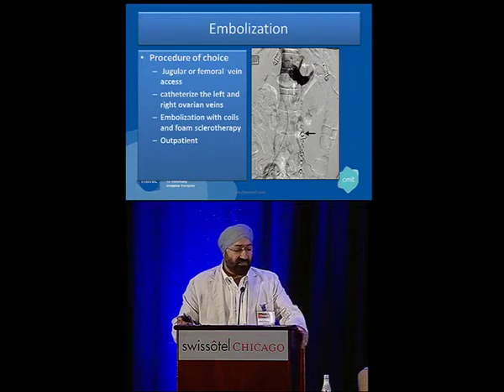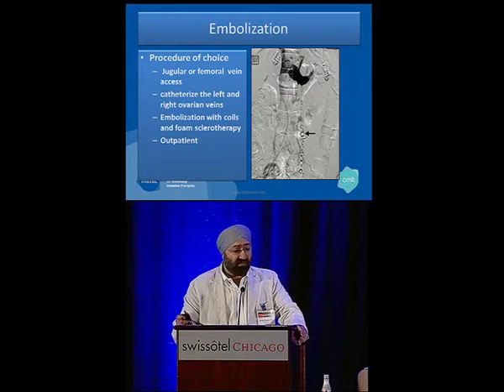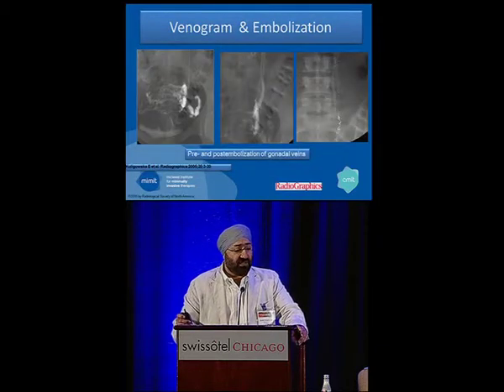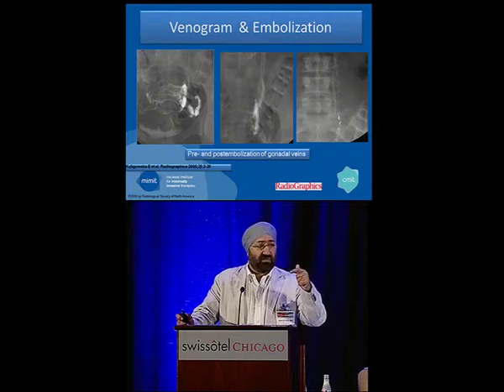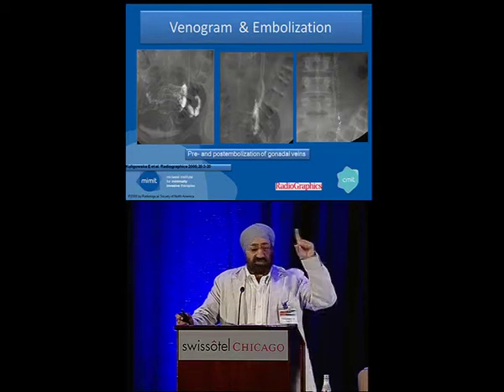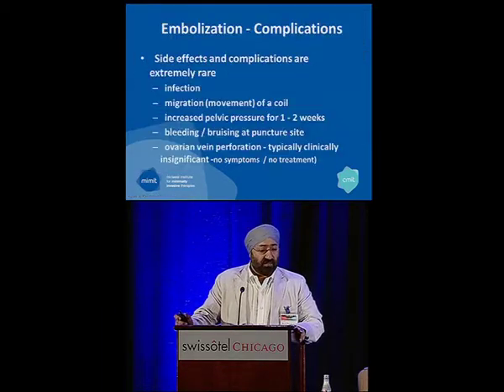As we talked about, embolization is an outpatient procedure. They come in, I give them some pain meds before doing the procedure, and as outpatients, they're home by the end of the day. It's fairly easy. Routine, simple catheter technique, go up the femoral vein, up the left renal. It's rarer on the right, but if we see a reflux, we go all the way through, then I'll go up and do the right as well.